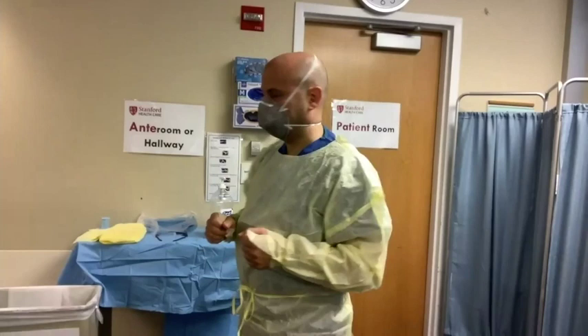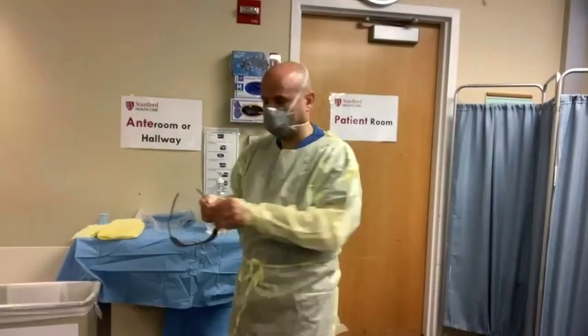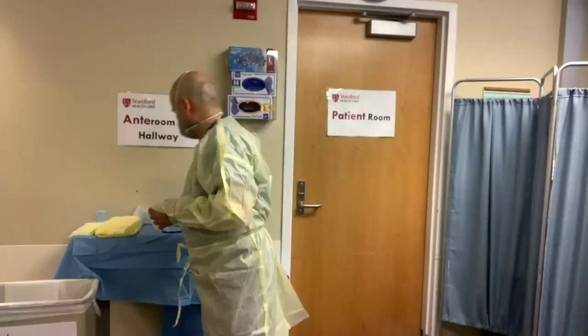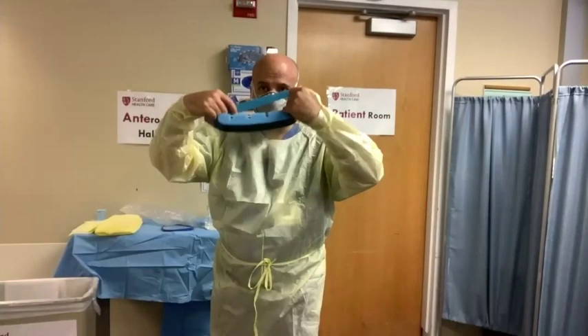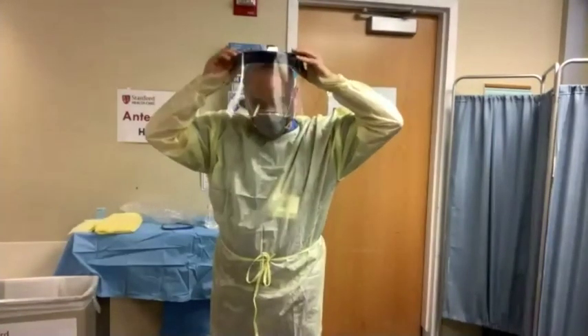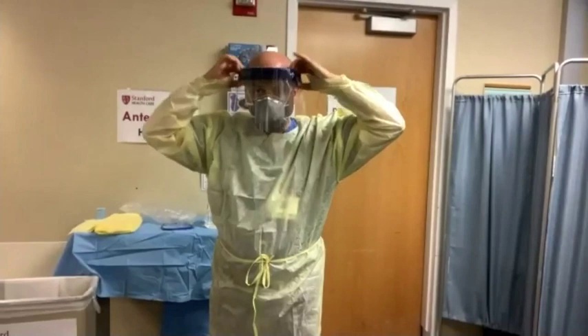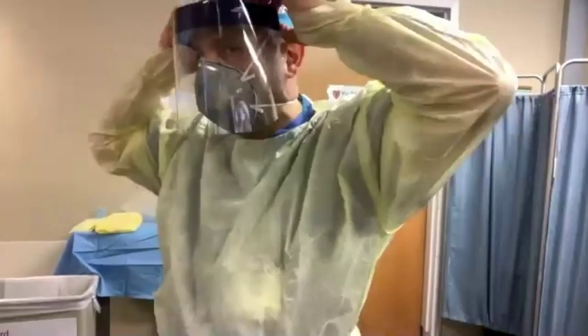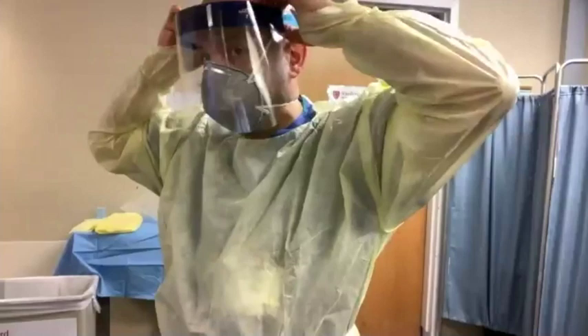Now you're ready to don either your goggles or your face shield. We're going to use goggles for the purposes of this simulation. If you're using a face shield, start by placing the elastic strap over your head. Ensure that the foam top of your face shield is resting in the middle of your forehead, then check that it covers the front and sides of your face.